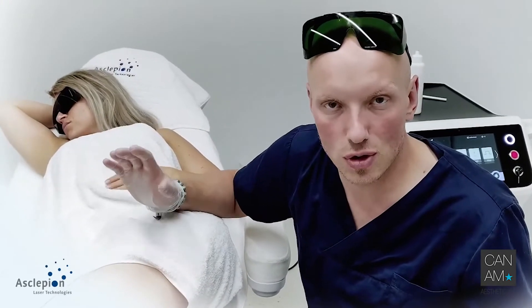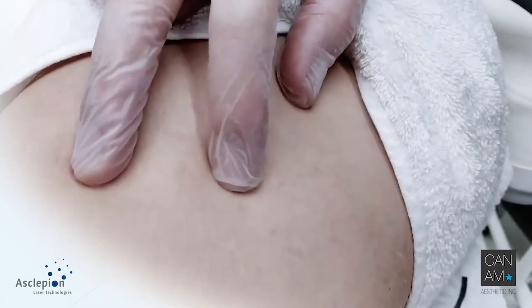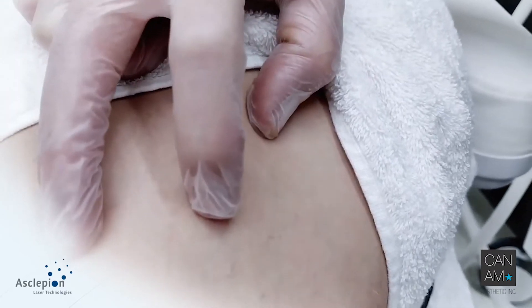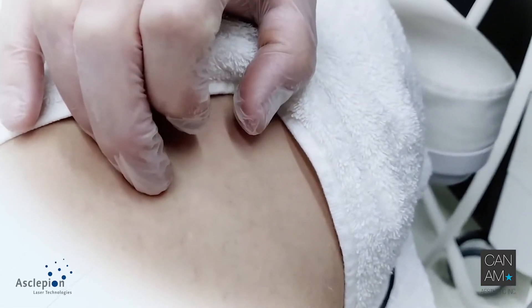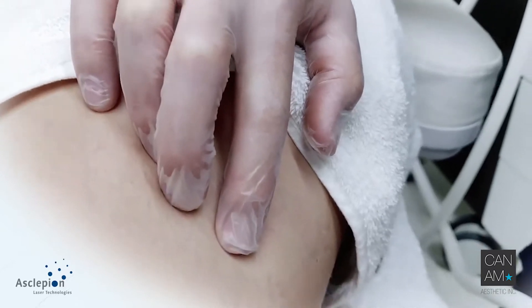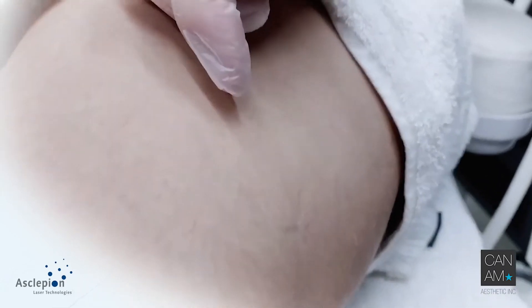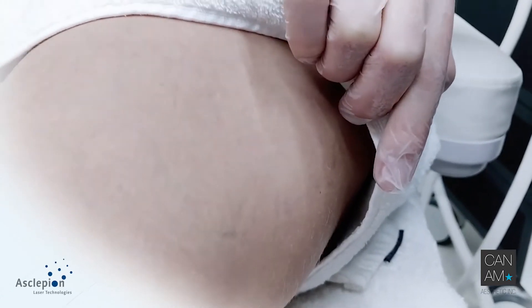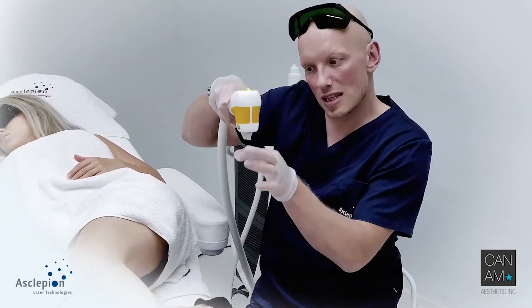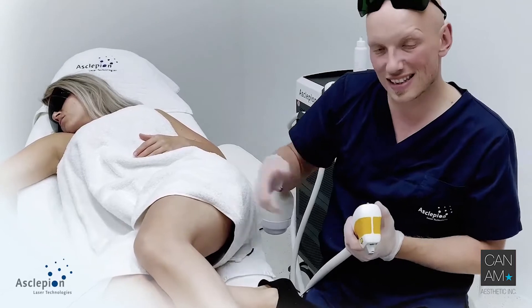Preparation: first, you go for a compression test. That means you check out the bloodstream — just like this. This is the way the blood goes. The blood flows from here to there. If this compression test is not enough, then just try to put it like that or like that. Start at the very end where you can barely see the vessel. Start with 90 degrees, and then work against the flow at 45 degrees for this depth.